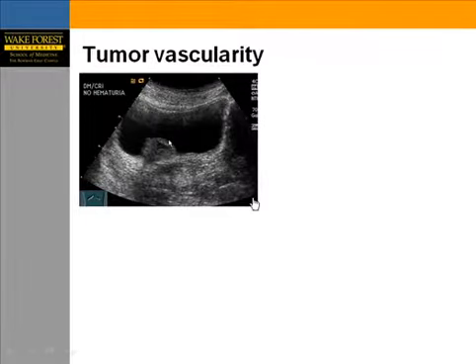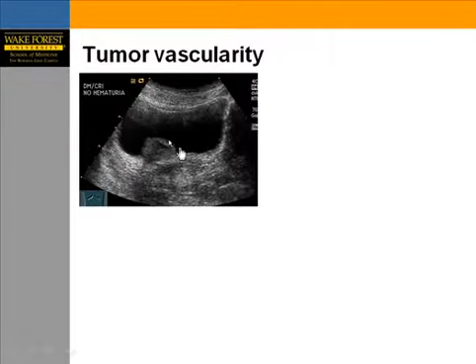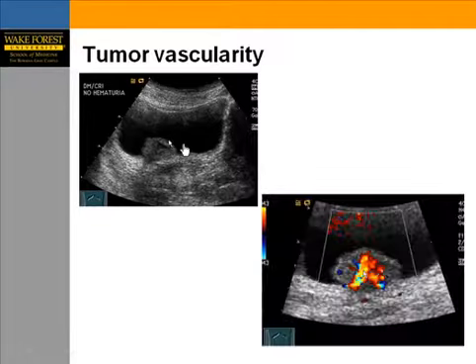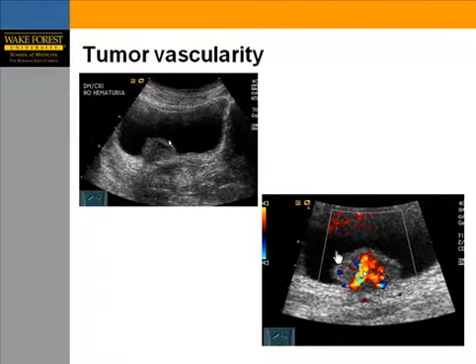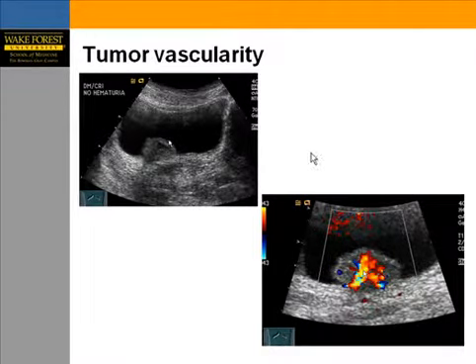Another patient who presented for renal ultrasound — during the examination, we incidentally identified a soft tissue mass in the bladder. We applied color Doppler and it was avidly vascular. The patient did not have hematuria; nonetheless, she was taken for cystoscopy and biopsy-proven transitional carcinoma that was asymptomatic.